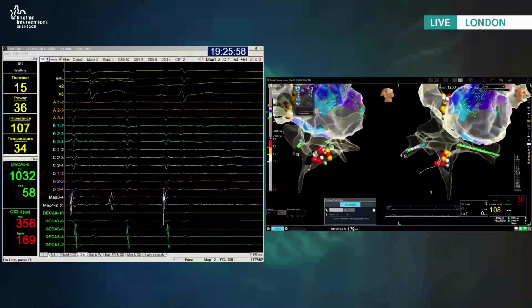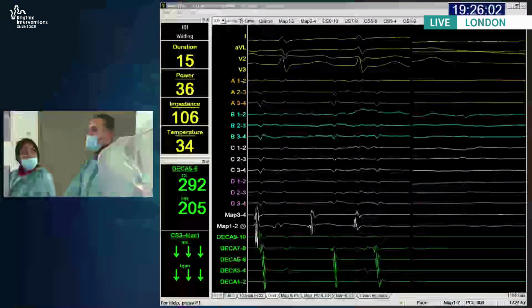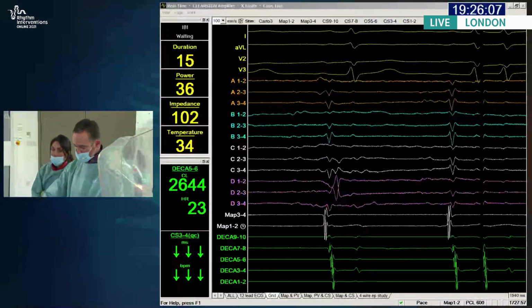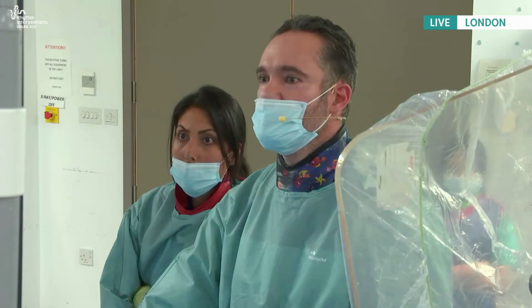So at this point, I would go on and check the veins, and I would ordinarily be done really for a persistent AF. I suppose I could make arguments about giving adenosine and things, or isoprenaline. Do people on the panel do that at all? Should I go back to PA and left lateral? Jan, do you give adenosine? No, we don't, also based on the negative results from the trials, really.